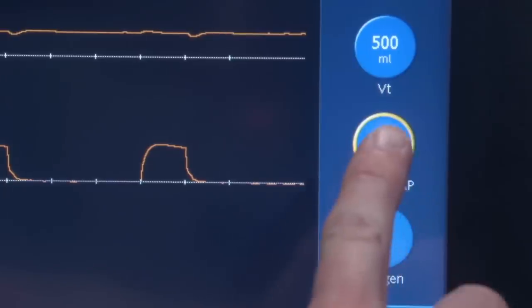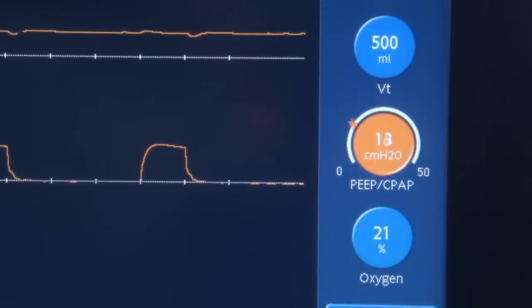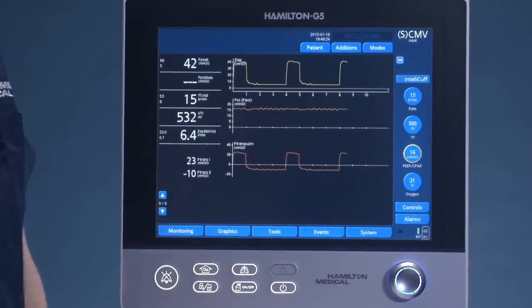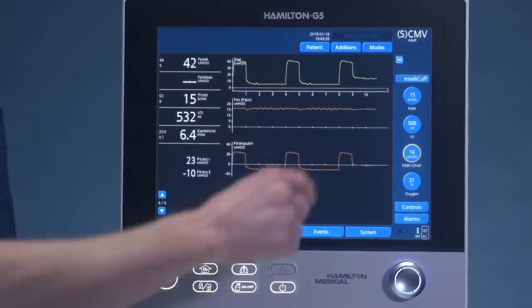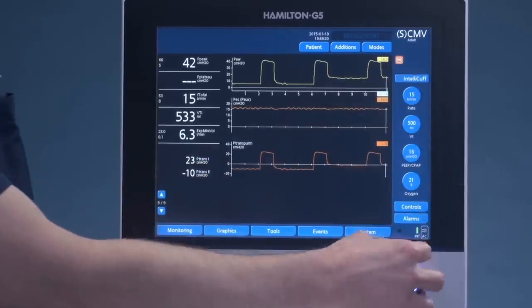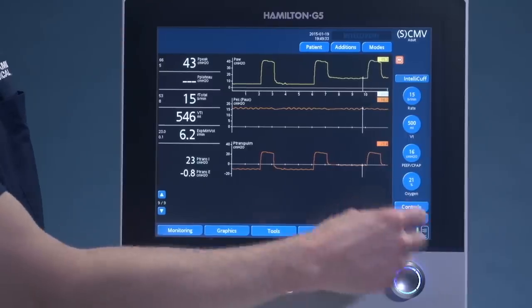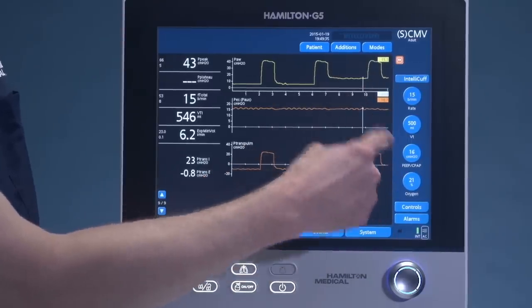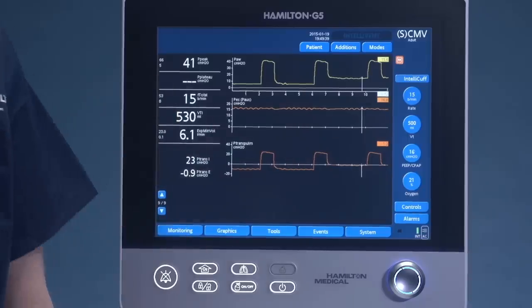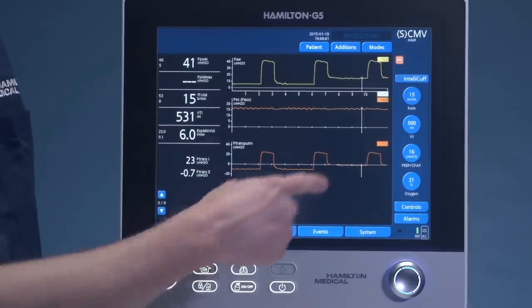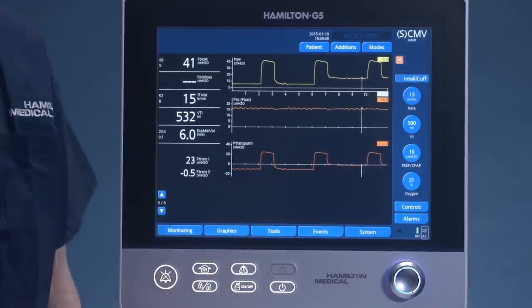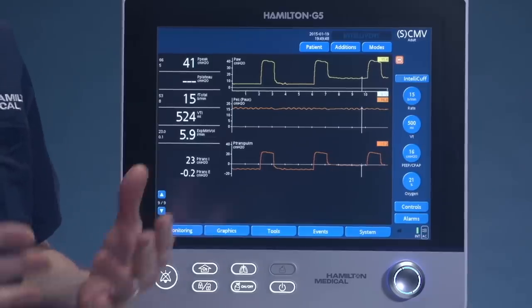Watch what happens when we increase the PEEP to 16 to equally match the pressure outside the lungs. Now, if I freeze the screen and scroll back, while airway pressure reads 16 in relationship to the PEEP set, the pressure outside the lungs remains 16 centimeters of water pressure, giving a balance of zero centimeters of water pressure — a transpulmonary PEEP of zero.